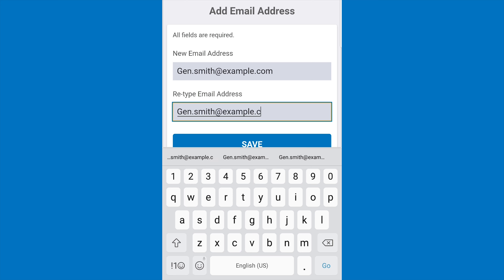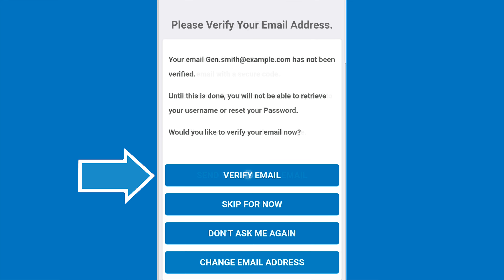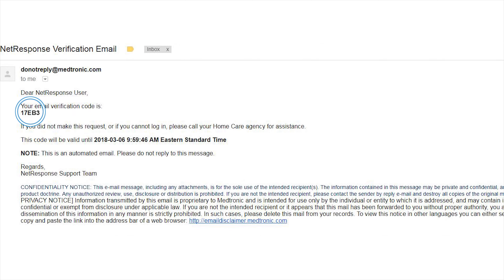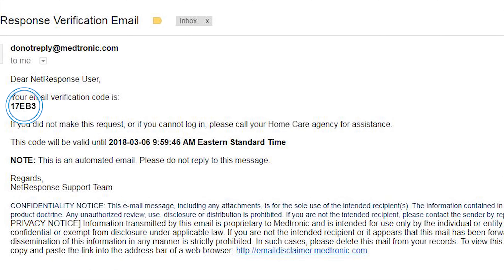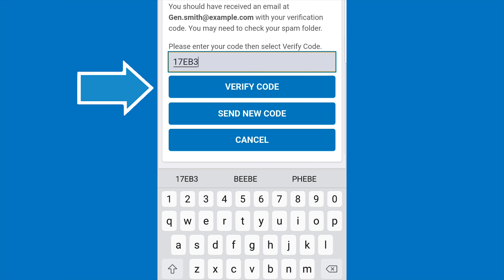If you choose to provide an email address, it will need to be verified. Select Verify email, then select Send verification email. An email with an activation code will be sent to your email inbox. Open your email to find the activation code and enter this code into the grey box on the NetResponse screen. Click on Verify code. The code will only be valid for 30 minutes, so if the time runs out, you can always request a new code by clicking Send new code. Once your email has been verified, you will not need to go through these verification steps again.